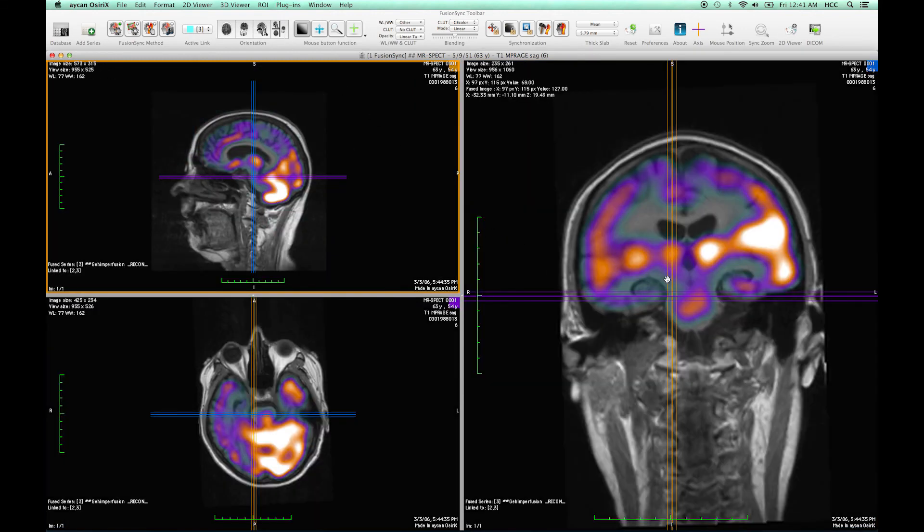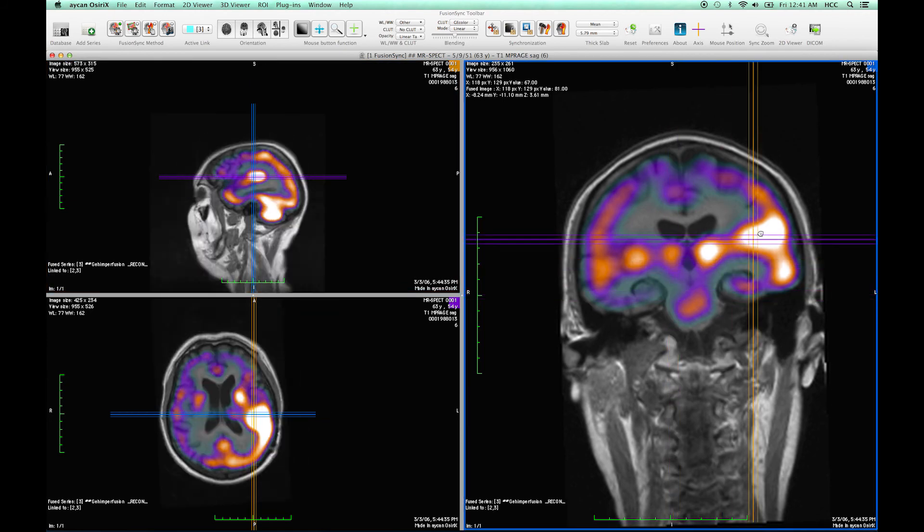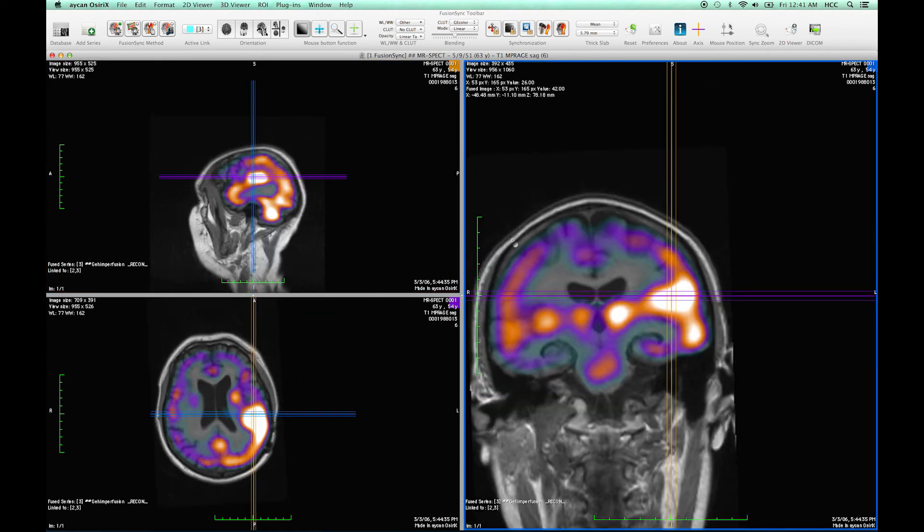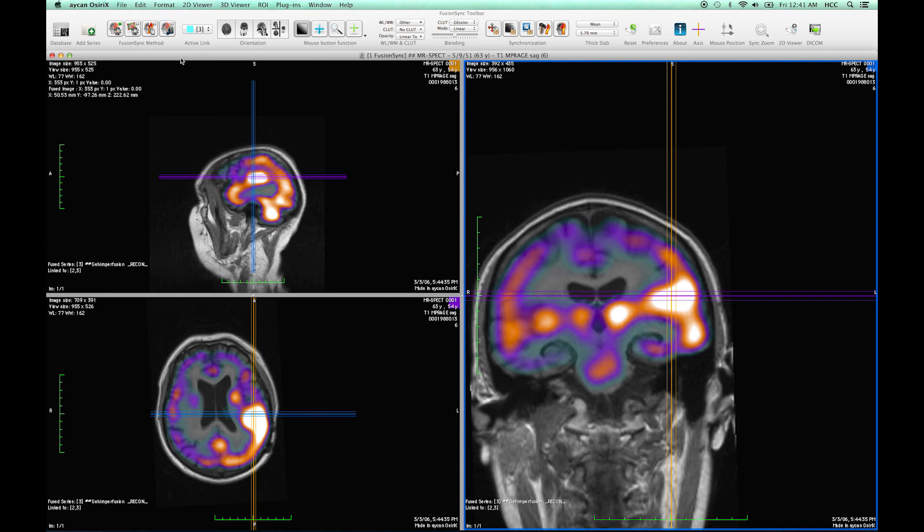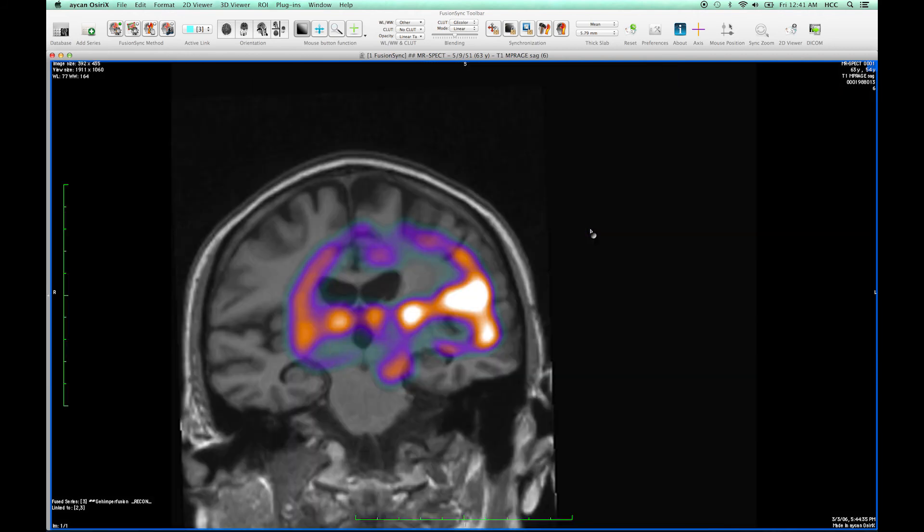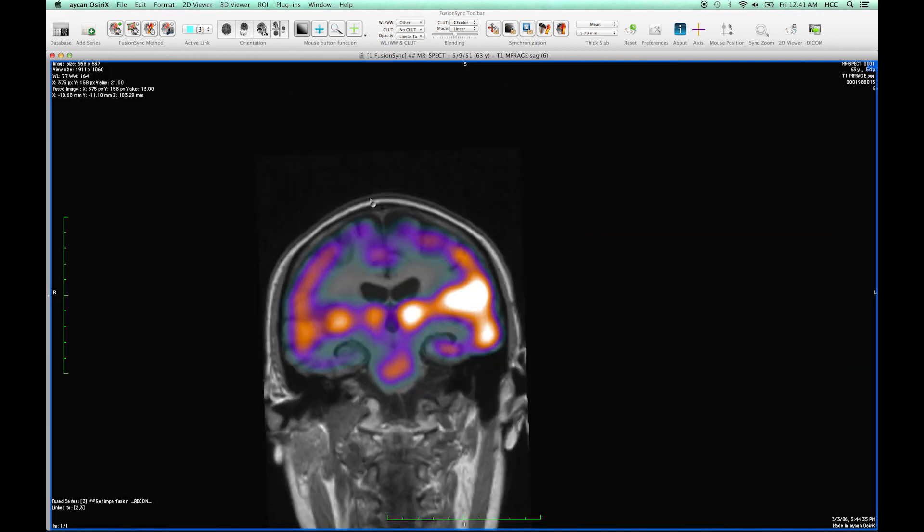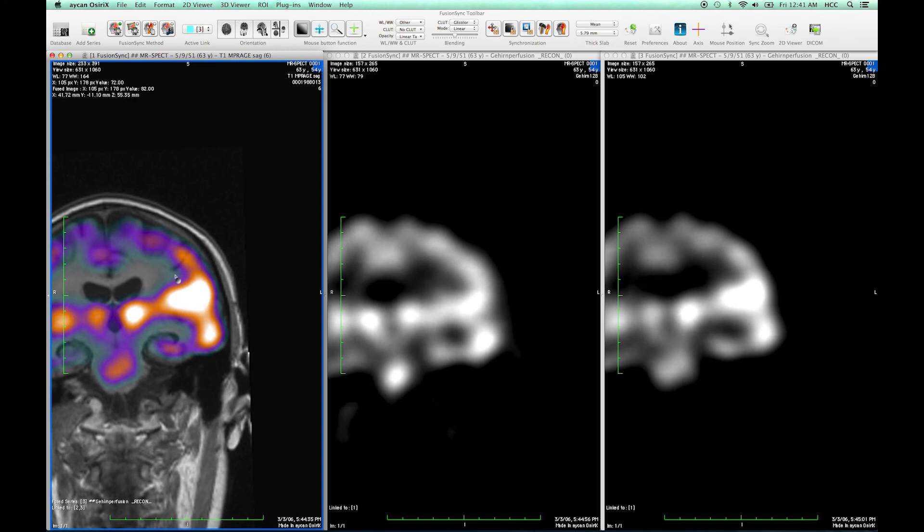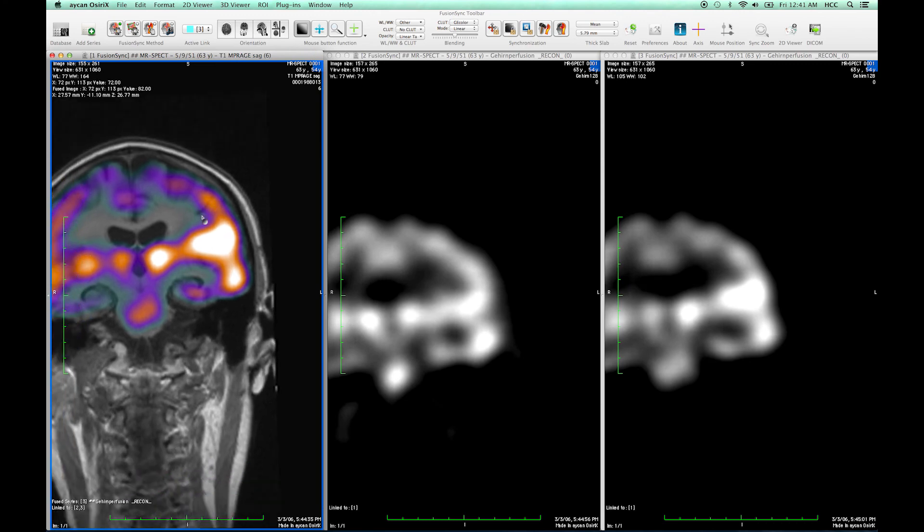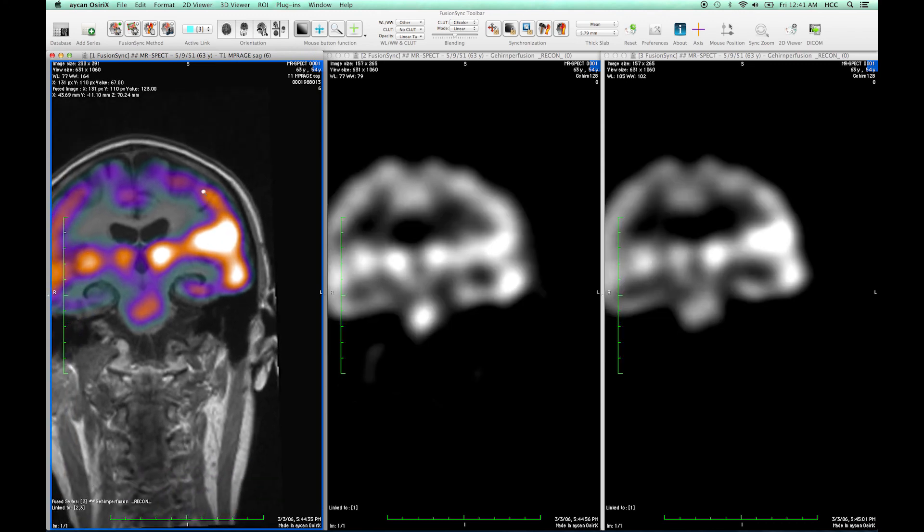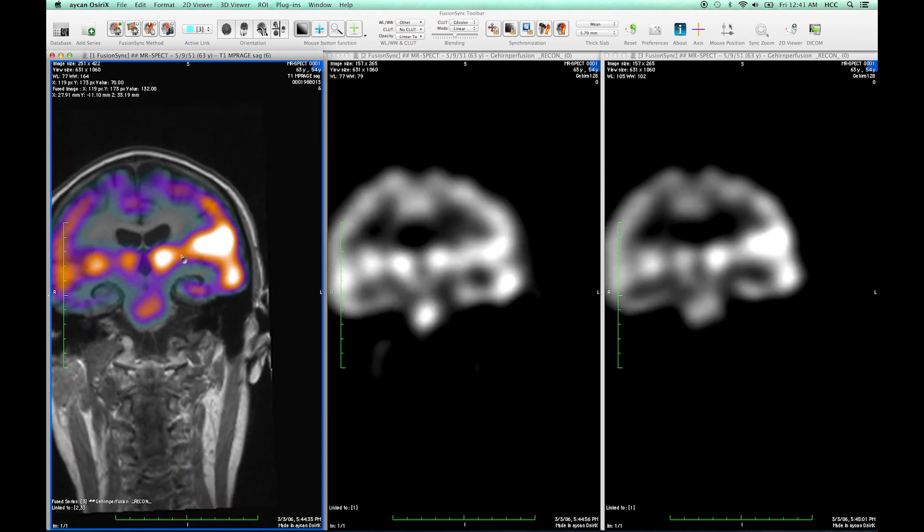Now the next steps would be to view the according images in more detail which is then simplified by the spatial synchronization within FusionSync and add for example bookmarks or view findings and additional information.